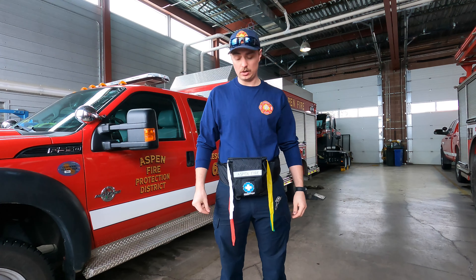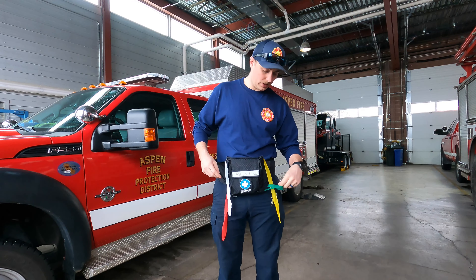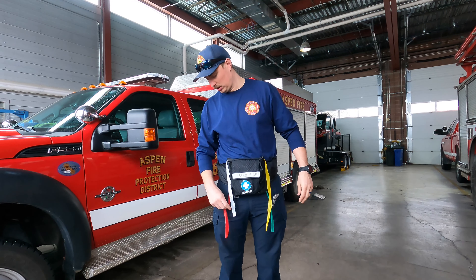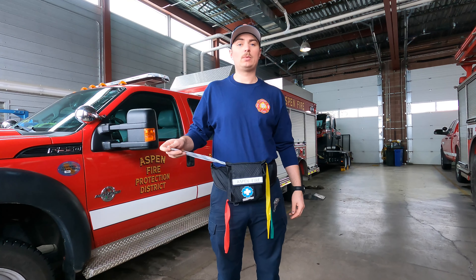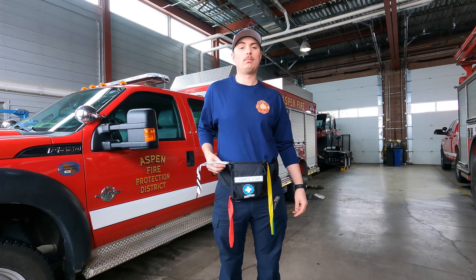On these pouches there's the main center front pocket that if you open up you will see two tourniquets in. On the side of the main pocket there are four rolls of tape to be used during initial triage. There is green, yellow, red, and the white and black striped tape is to be used to denote black patients.